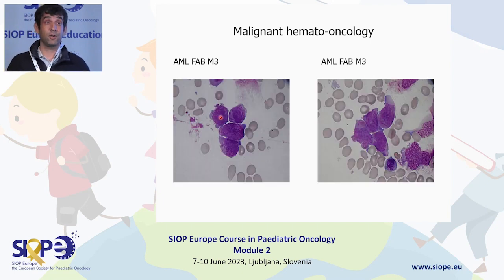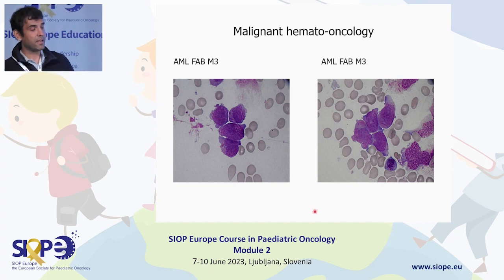M3, this is an emergency, I think everyone knows, and we cannot wait for a pathologist on the weekend. You must make the diagnosis immediately, because if you don't make it, the patient can die from a life-threatening bleeding, from an intracranial hemorrhage.